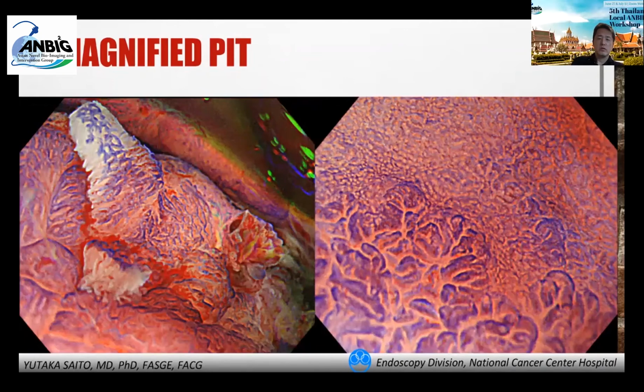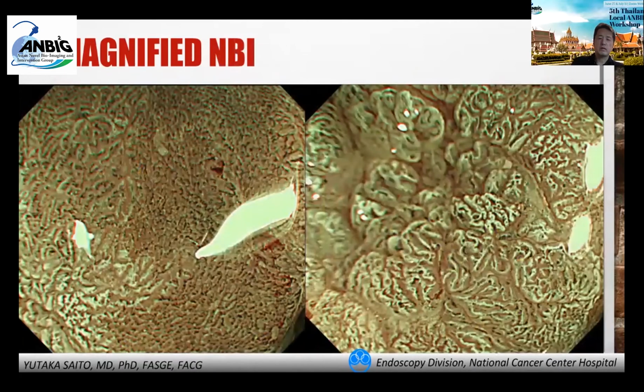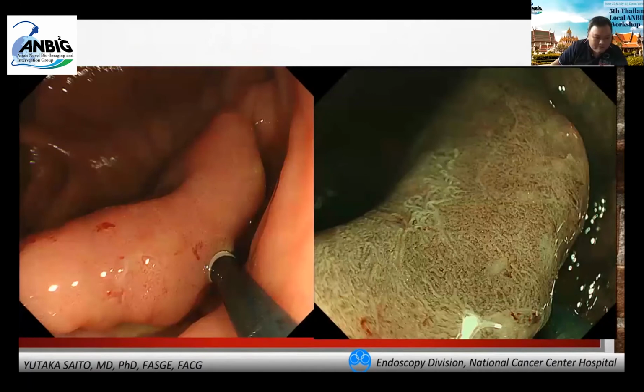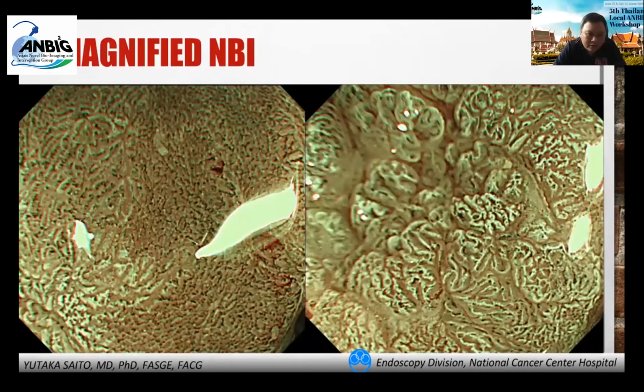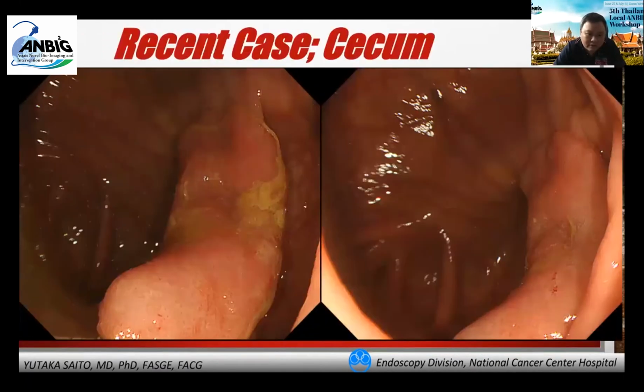So no Q&A slides, but Doctor, how do you diagnose this lesion? I think it is a non-invasive lesion. So I think I will go on with the endoscopic resection, the ESD, for this kind of lesion after the details that you gave me. So all of the details indicate it is non-invasive.